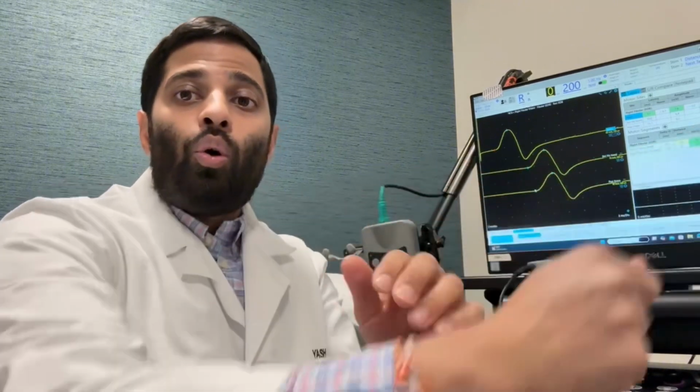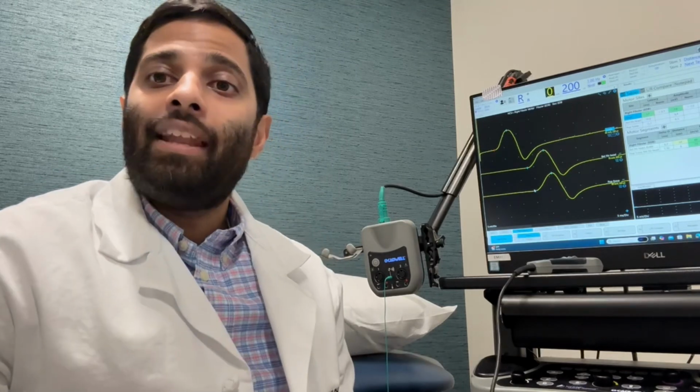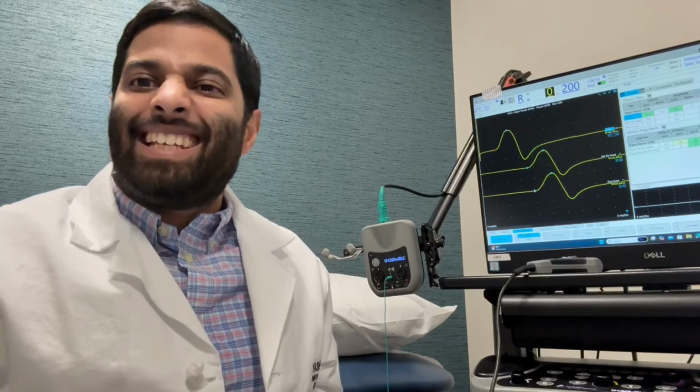What clothing should I wear? So similar question, right? If we're doing your arms, we want to be able to get to the shoulder region and do the whole arm. So we recommend a loose fit t-shirt or a short sleeve t-shirt so we can roll it all the way up to the shoulder. And then otherwise loose fit pants or shorts if we're doing your legs, because we need to get to the mid thigh region. Obviously, if you don't have these available, no big deal. We can always give you a gown to change into.